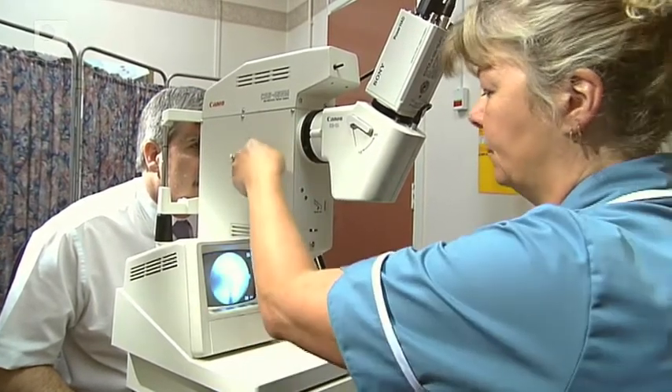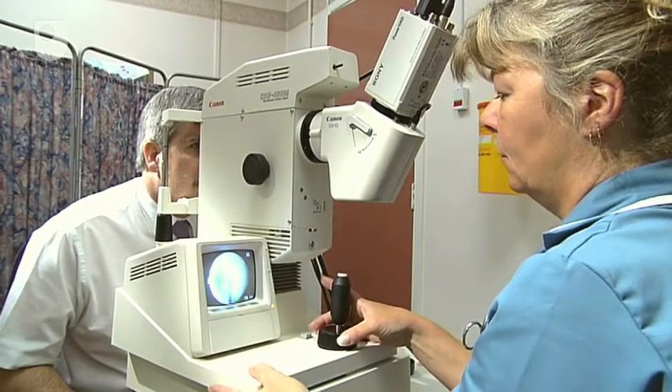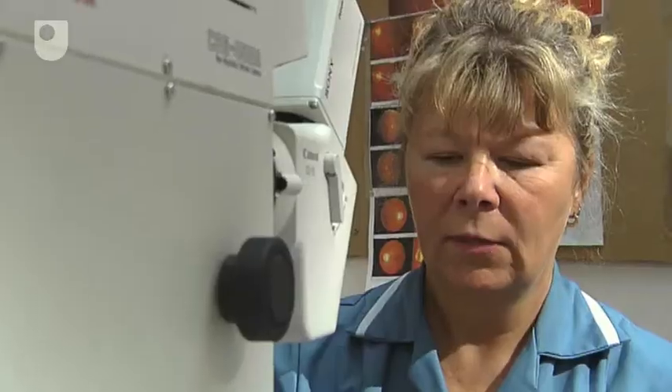You're doing really well. Can you see the green flashing light? Yeah. If you can focus on the green flashing light for me.